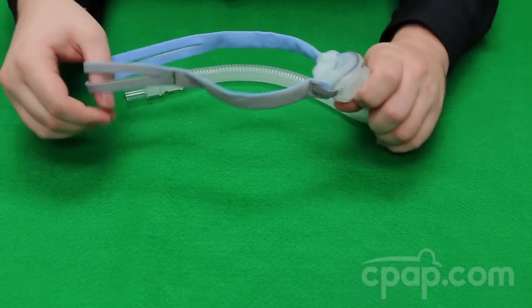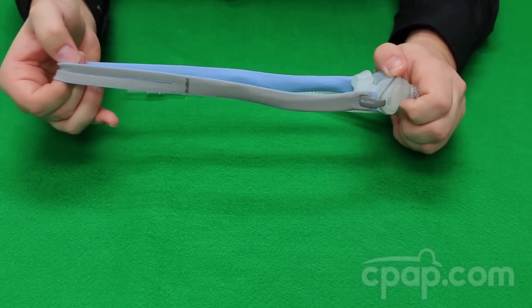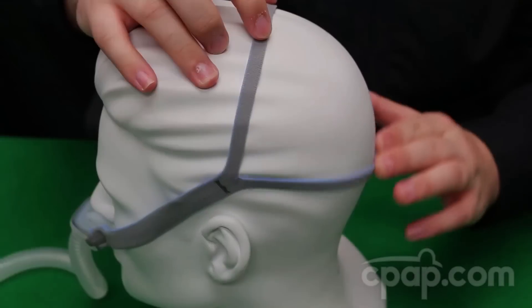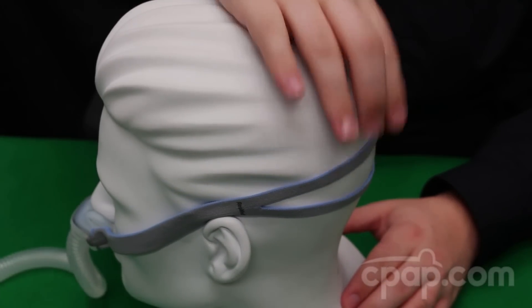The AirFit P10 features new quick fit headgear which is made of elastic cloth meant to stretch to provide a secure fit. The split back strap can be widened apart for a looser fit or narrowed together for a tighter fit.